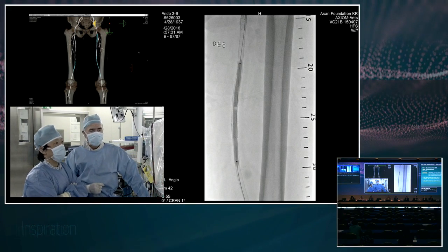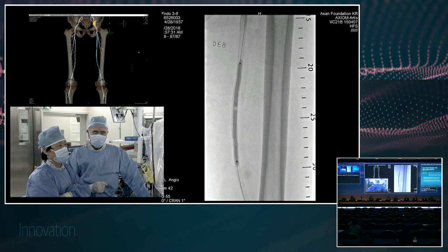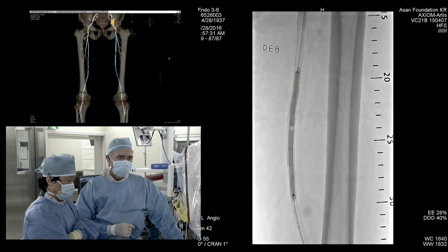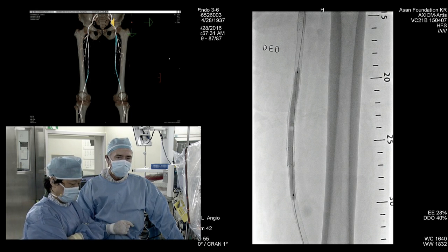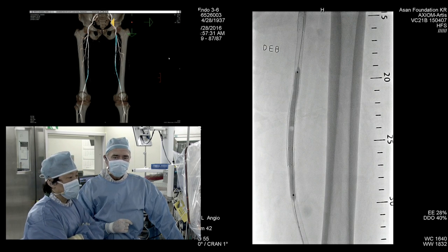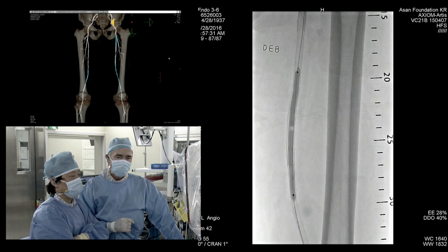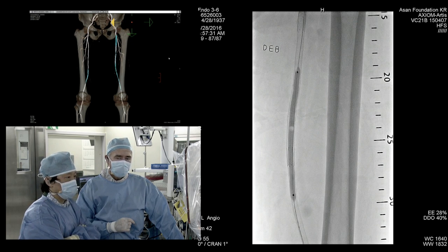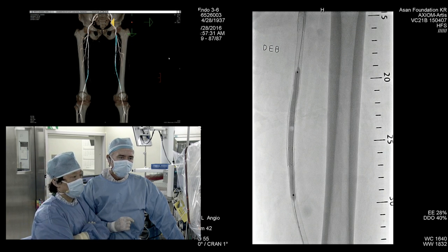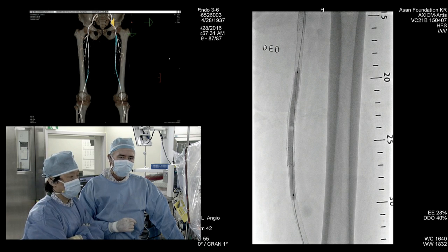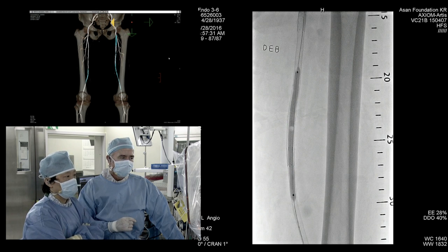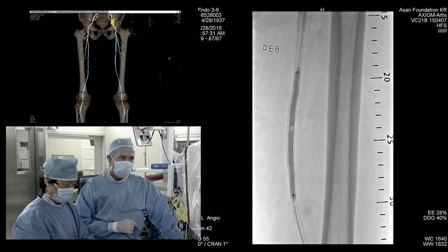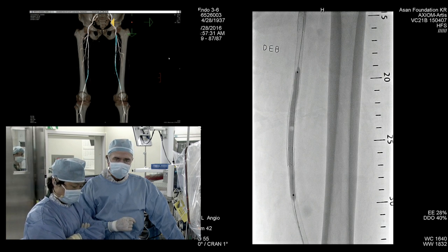This case fits nicely with the Medtronic Global Registry ISR cohort — mean lesion length was 17 centimeters, almost exactly what we're dealing with here. About 150 patients in that cohort, without debulking, just pre-dilation and DCB alone. Despite that, results were excellent: patency in the 80s at one year and TLR rate less than 10%. There was bailout stenting in about 14% of those cases. Debulking is theoretically attractive, but there's not a strong body of evidence proving it. Pre-dilation and DCB alone is very appropriate.